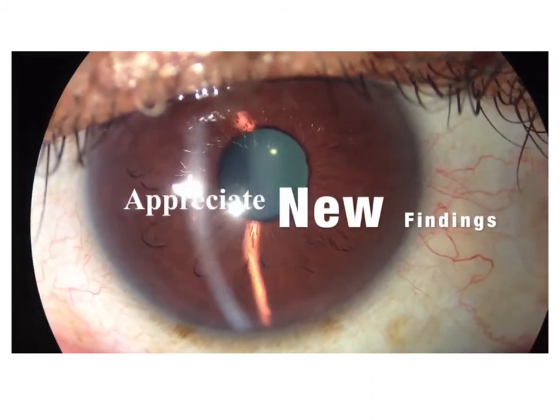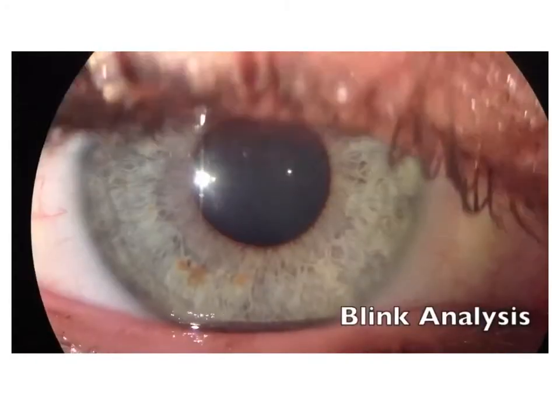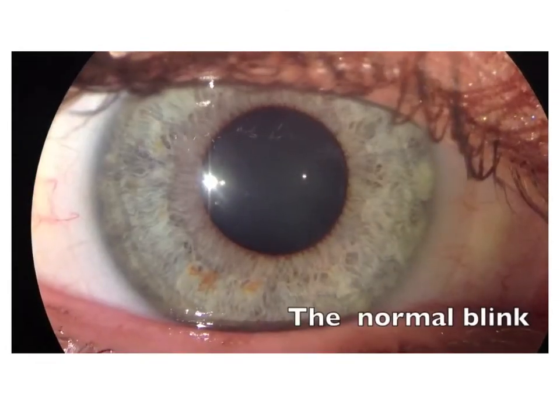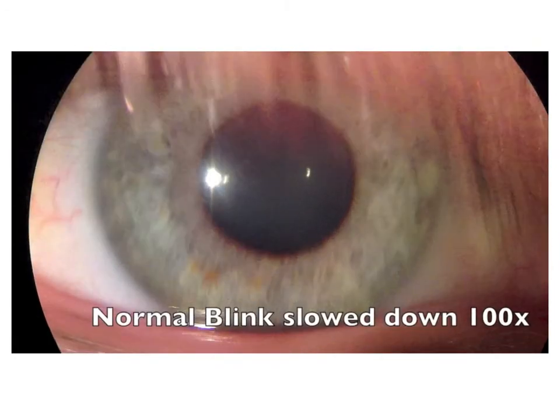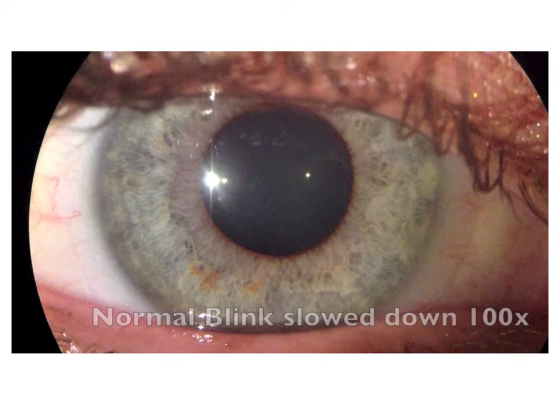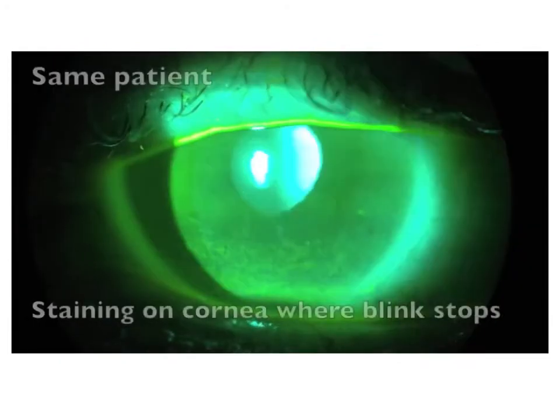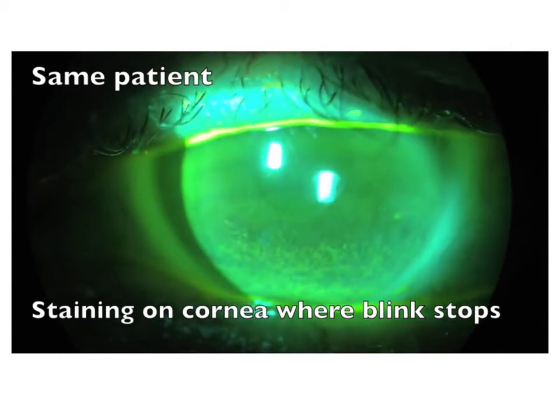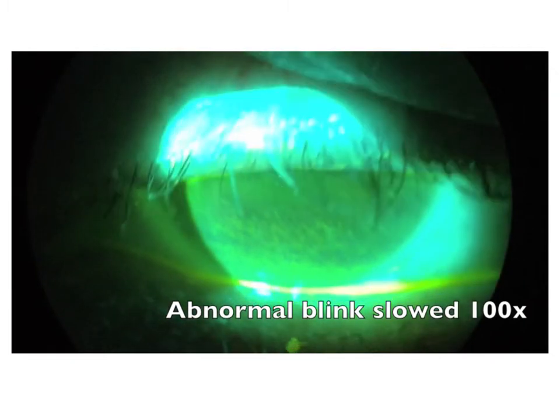One of the nice things about the dynamic tear film analysis is it helps us to appreciate new findings. Here's the blink analysis. If we slow it down with the SlowPro app, we can see that — that's the normal blink with the SlowPro app. As you can see, we have full closure. Whereas when we look at an abnormal blink, it has more of a fluttering type of appearance. And here's the same patient — you can see that there are a lot of SPKs right where the lid stops. Here it is slowed down again with the SlowPro app.